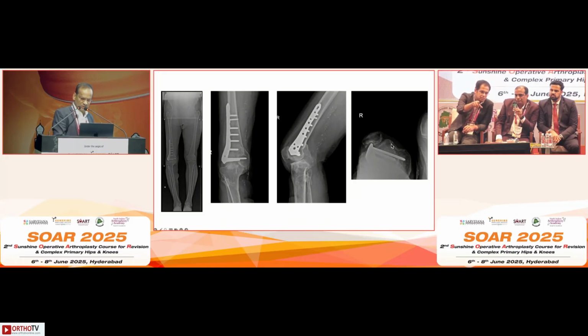And regarding range, as you see, the distal femur is internally rotated and malunited. That is the reason why the patella is subluxated laterally and is hitting the implant. You can also see in the coronal plane the distal femur morphology is quite abnormal. So do we still go with the robotic and a standard implant, or will you go with a more constrained implant? No, backup is always constrained. If you can get away with technology and a less constrained implant like PS or CR, that should be great.